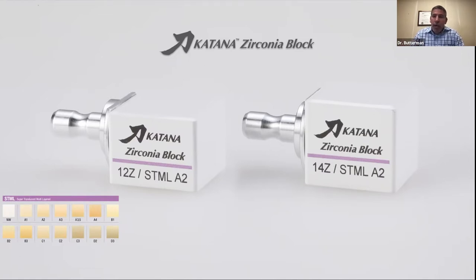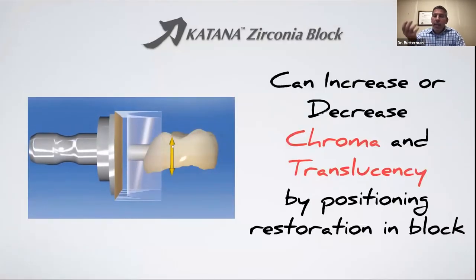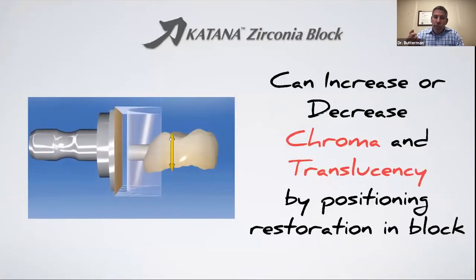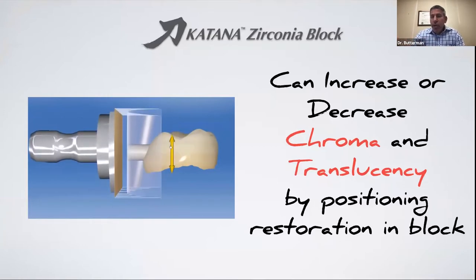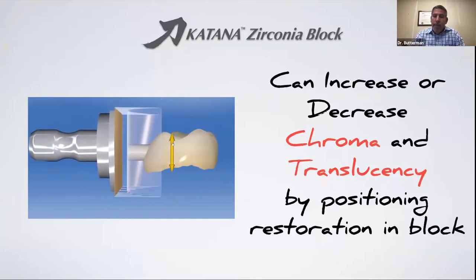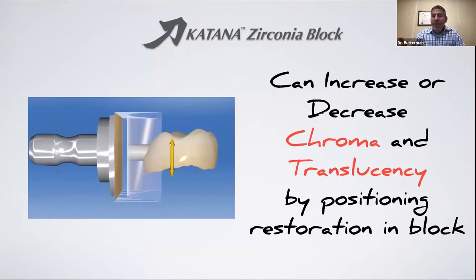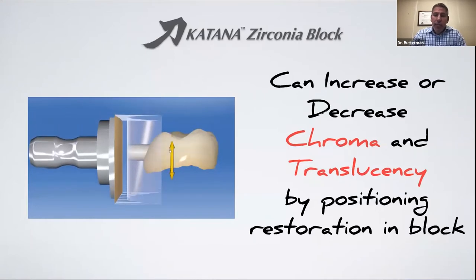And I think that the cool thing about this material, the STML, is super translucent, multi-layer zirconia. So we have multiple colors, multiple layers going through this material. And then on top of that, we've got the ability to adjust the chroma and the translucency. So if you take your block and you go to the manufacture phase, you can actually move your restoration up or down within the block to increase or decrease the amount of translucency. And that's really, really nice because we're going to be able to basically polish most of our restorations and have an aesthetic result that's going to be nice.